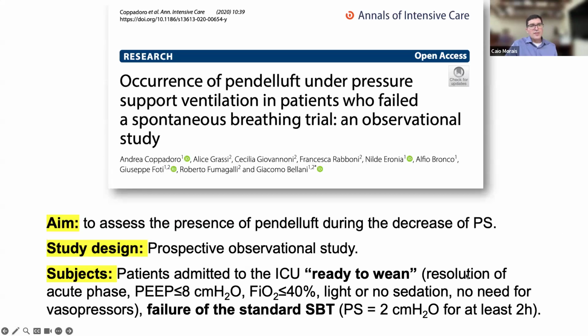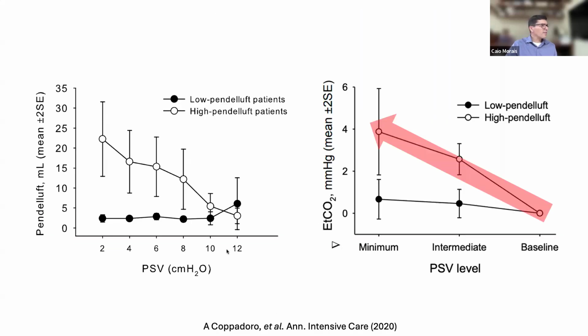Considering now pendelluft and weaning, this is a nice paper by the group of Giacomo Bellani. The first author is Andrea Capadoro, where the authors assessed patients with EIT, patients that were ready to wean, patients that had the resolution of the ARDS cause with low PEEP, low FiO2, light sedation, but they failed. And what did they find?